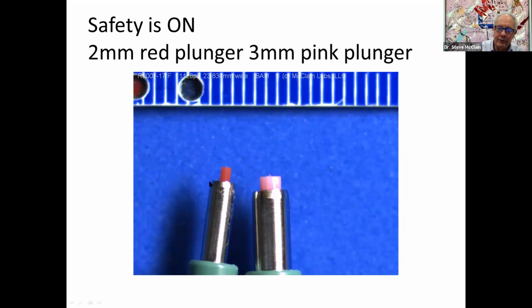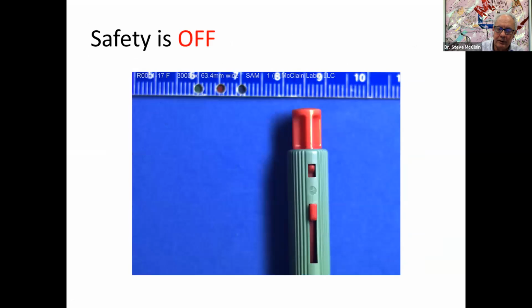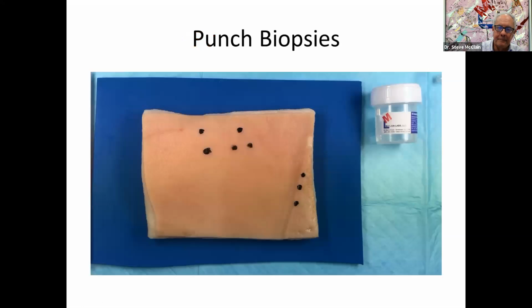And if you look at the other end, you'll see this is the safety position. And they have different sizes. This is a 2, this is a 3, and they're color coded. I like this company, but they come in all different flavors from all different companies. But this is a good one. It's by Miltex. Here the safety is off. You just push this button on the side to activate, okay? Much like an ink pen.